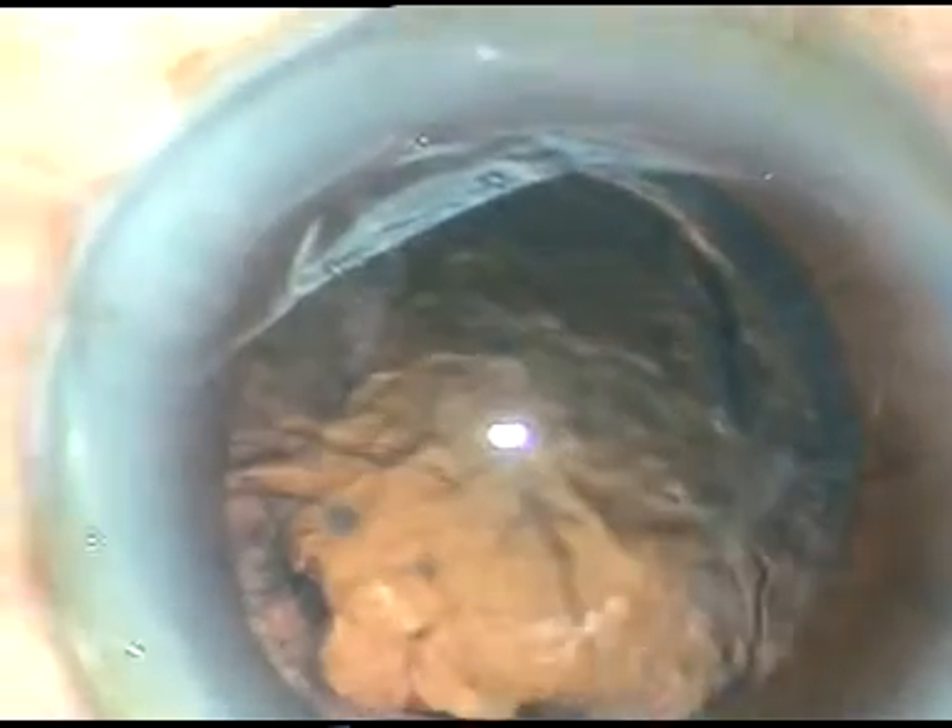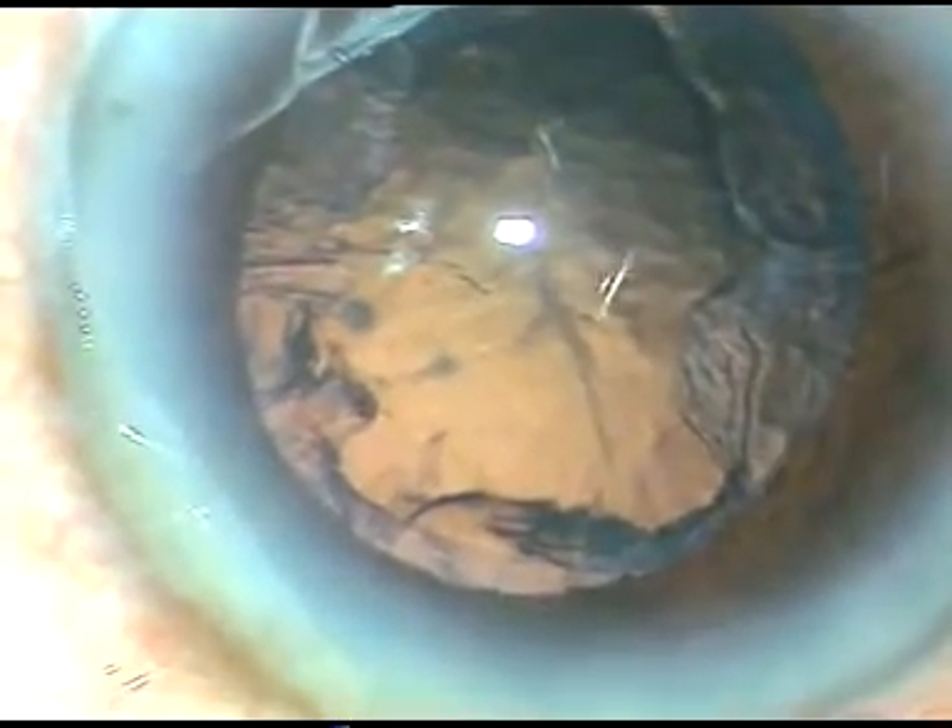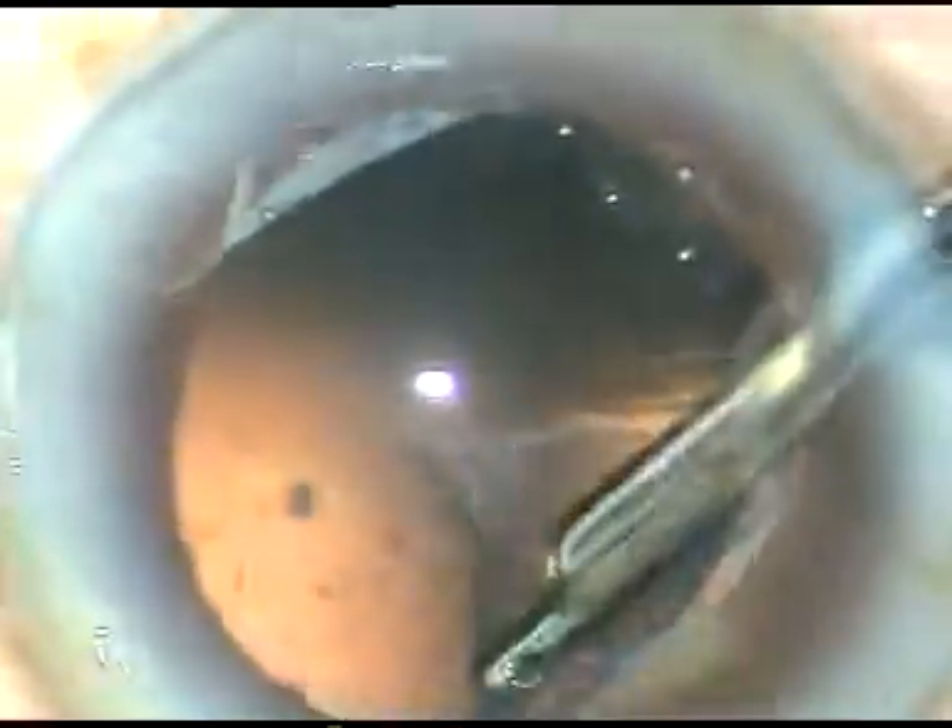A little viscoelastic substance is injected into the anterior chamber, and the cortical lens material is removed using this 23-gauge direct Simcoe cannula. This is a beautiful instrument — a very safe and controlled way to remove the cortex. The cortex is now removed.